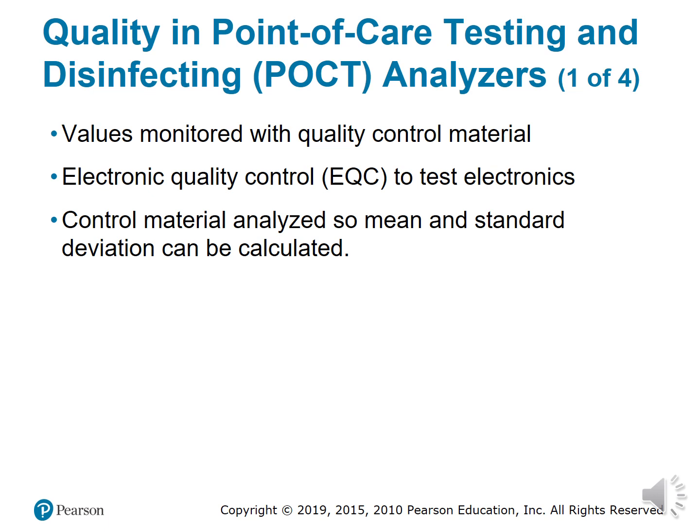Values monitored with quality control material is very important. Electronic quality control, or EQC, to test electronics, meaning some of the POCT testing, they're not really bedside, I know it says bedside, but sometimes we have to collect it from the patient and walk it to an instrument because it's not a handheld instrument.